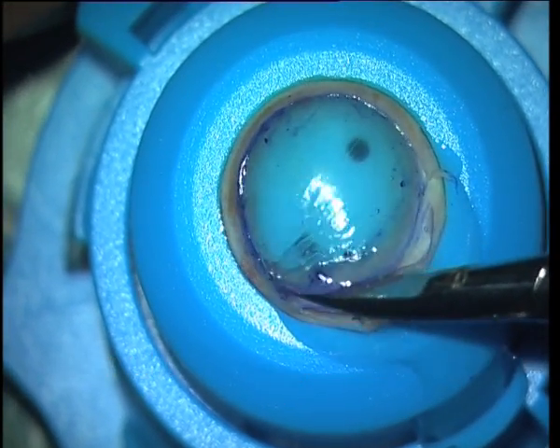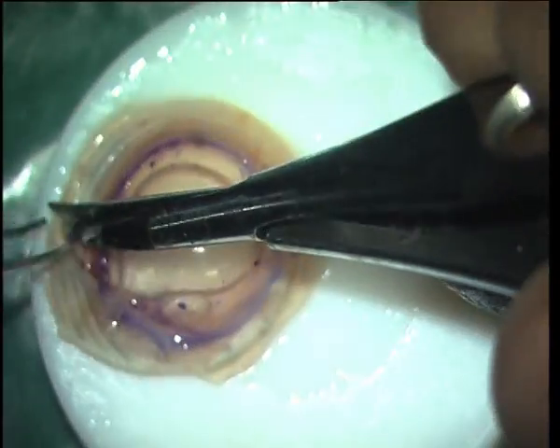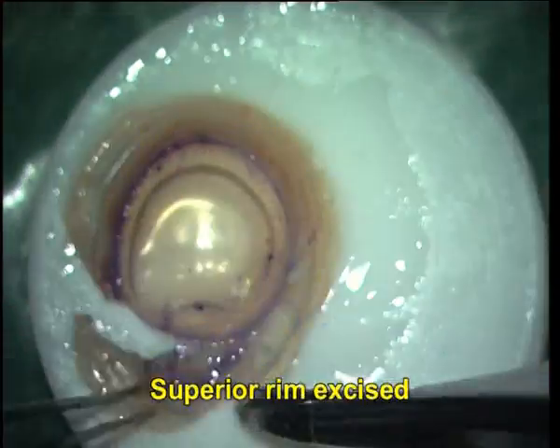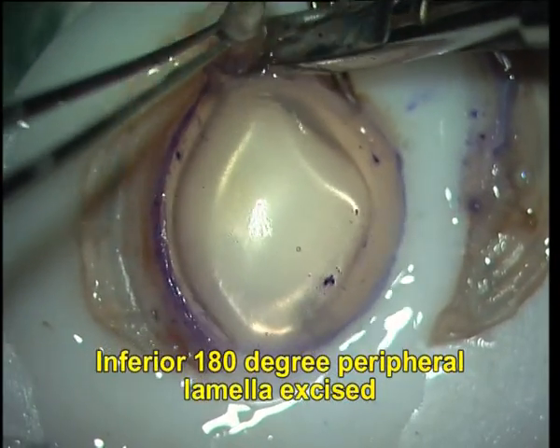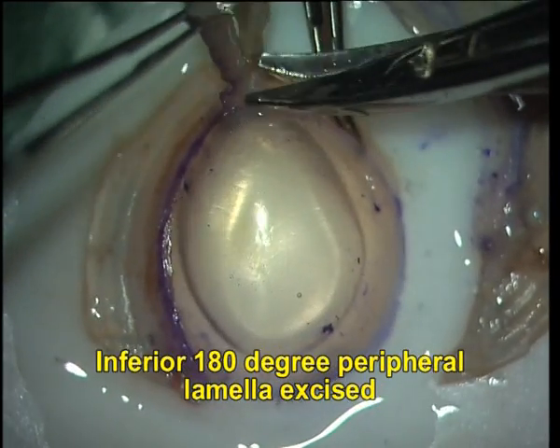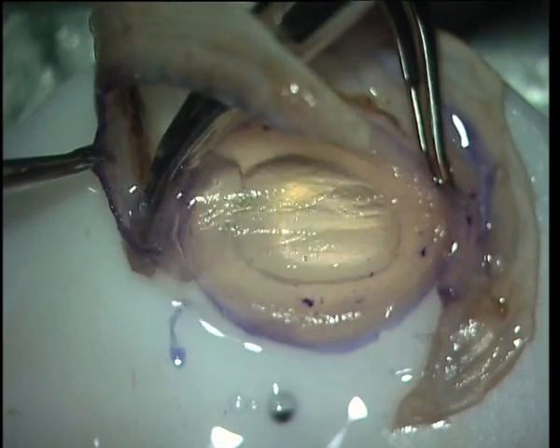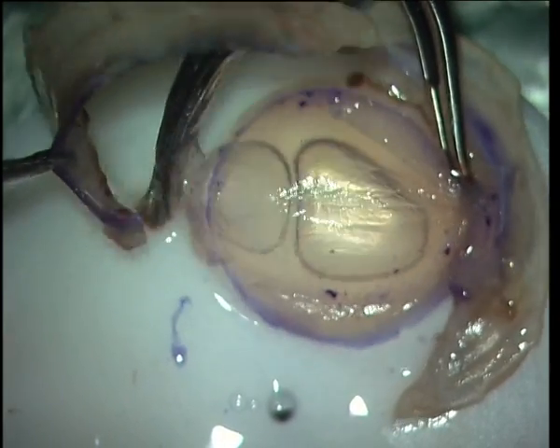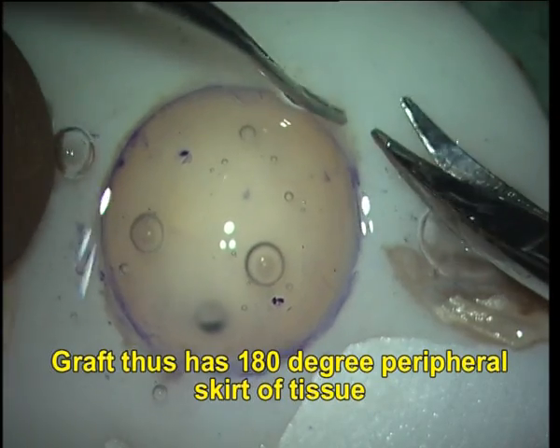Once I have done this, I cut the superior 180 degrees full thickness and then dismount the donor graft from the artificial anterior chamber. The superior rim is excised and the inferior portion of the inferior 180-degree peripheral lamella is also excised. This gives you a donor graft that has an inferior peripheral skirt of tissue, which is used to thicken the peripheral host stromal thickness.